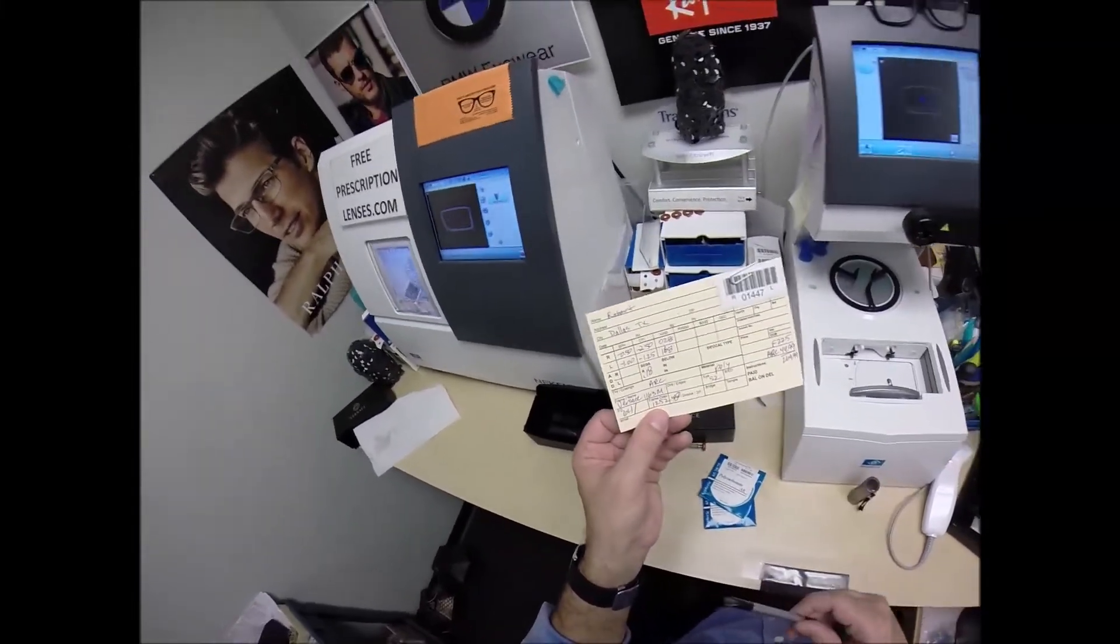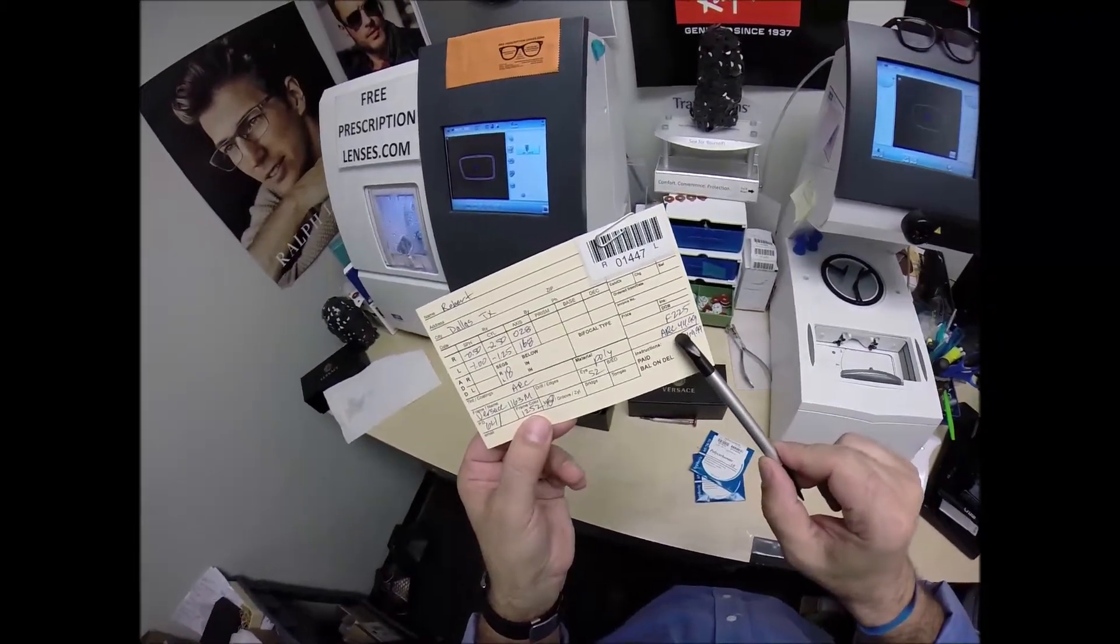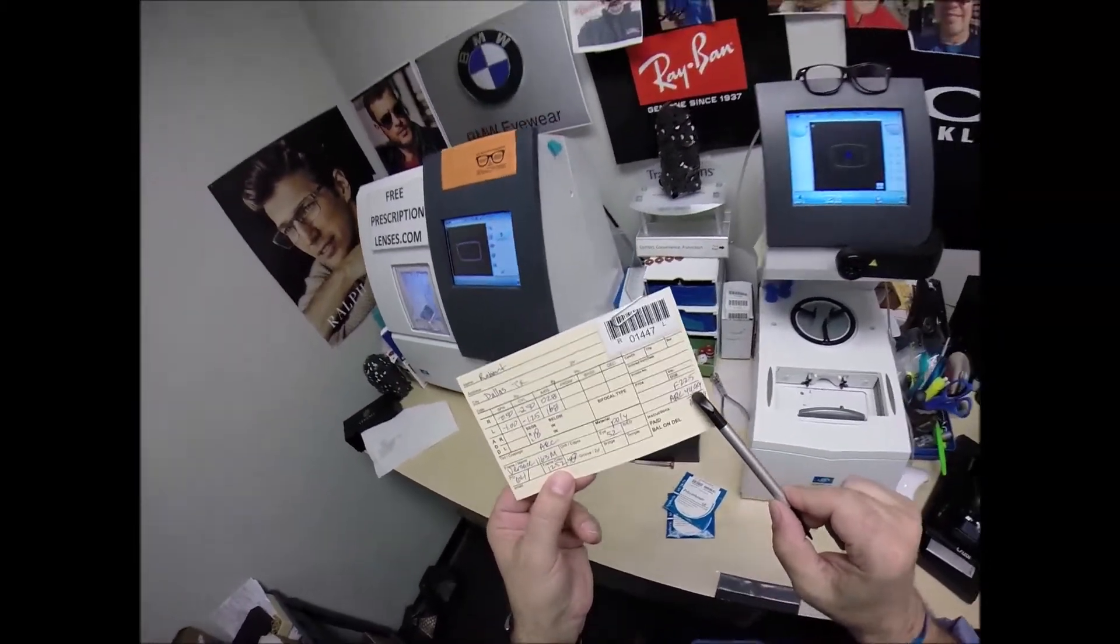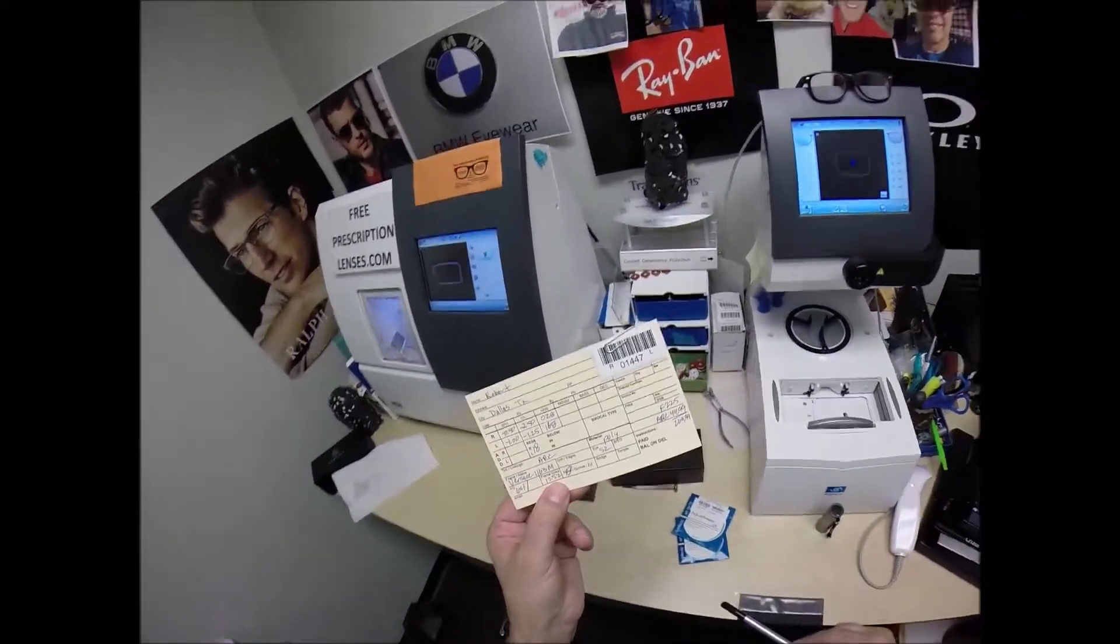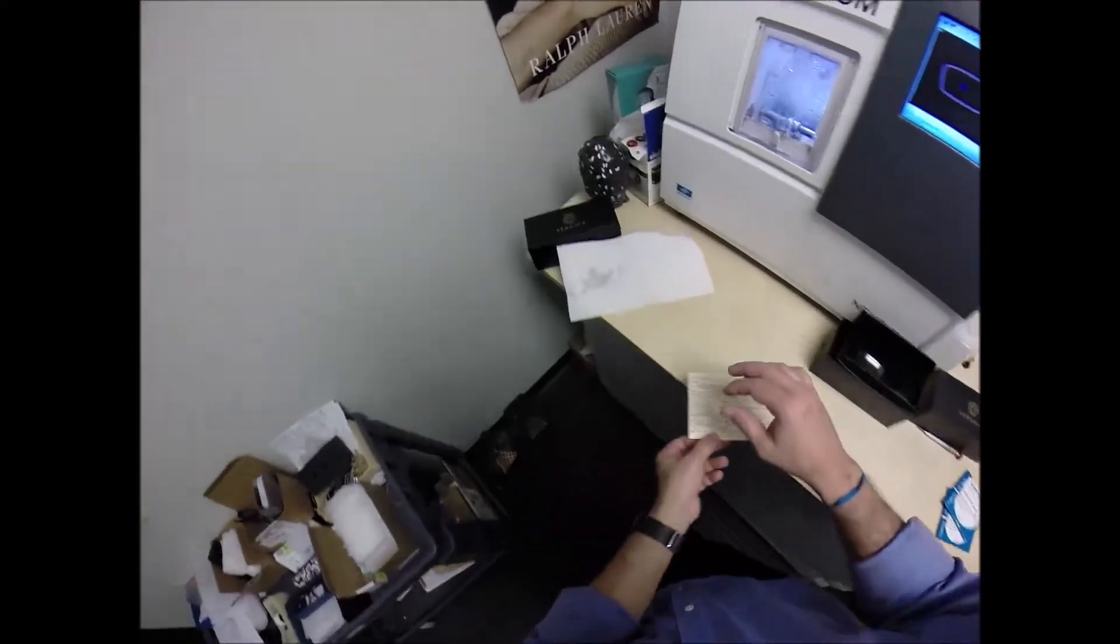Now, this frame sells for $225. The anti-reflective coating, the anti-glare coating, adds $44.99 for a total of $269.99. Now, I want to show you all something. What's hiding underneath here?